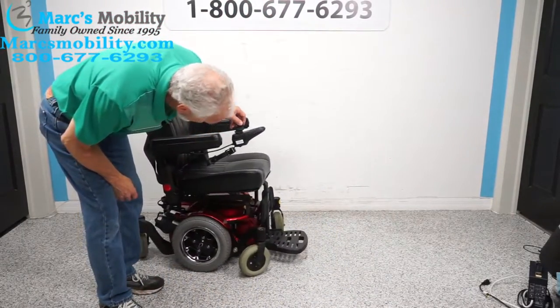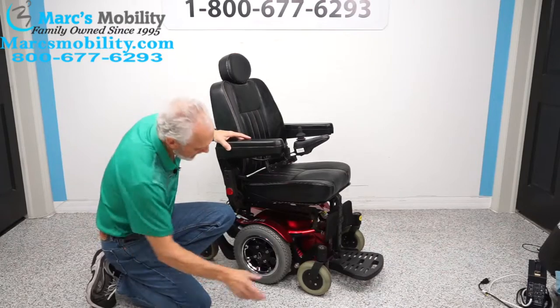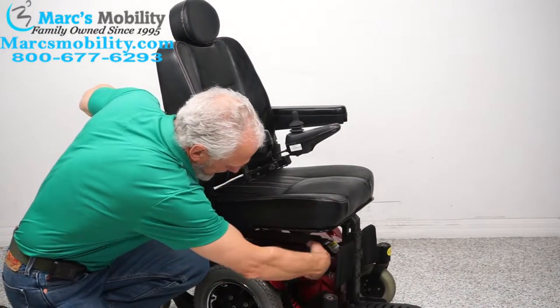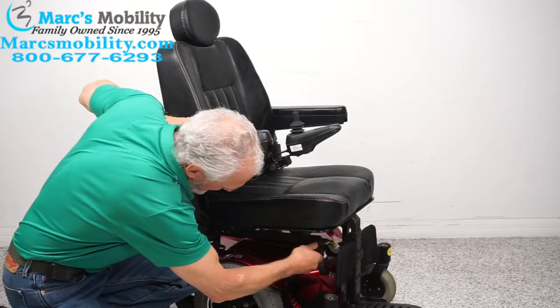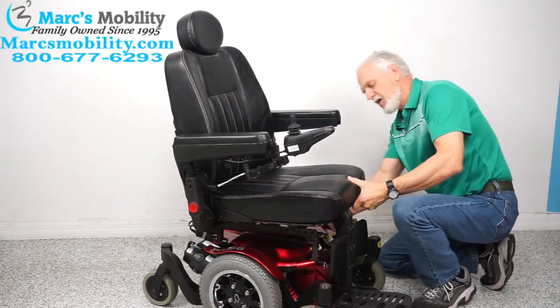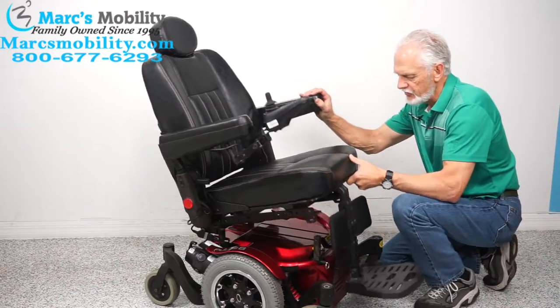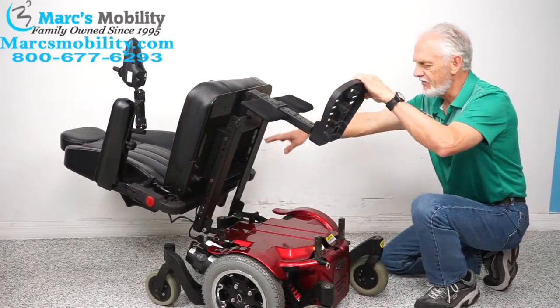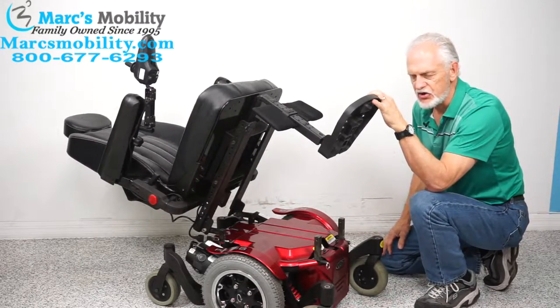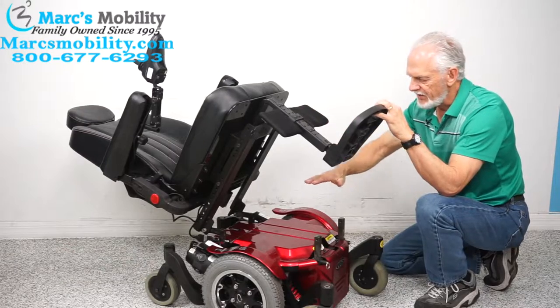If you ever need to change the batteries in this chair, it's very simple if you know how to do it. There's a knob right here — unscrew this knob on one side, then the same knob on the other side. Then pull the whole thing back all the way to the ground. Put a blanket on the ground and pull the cover. The two batteries are right here — that's how you change them.